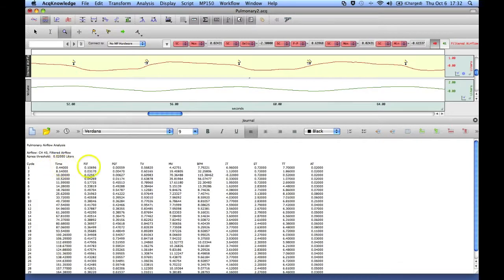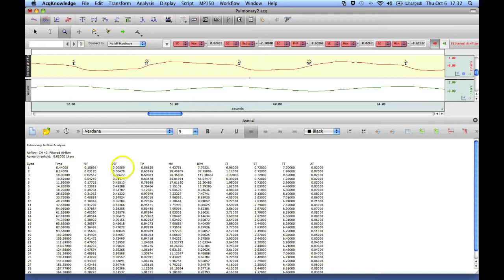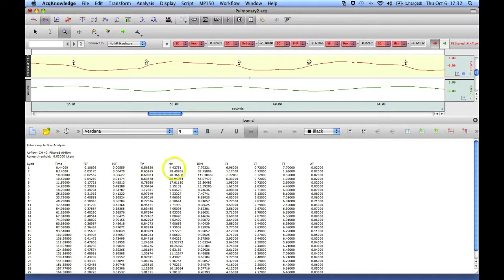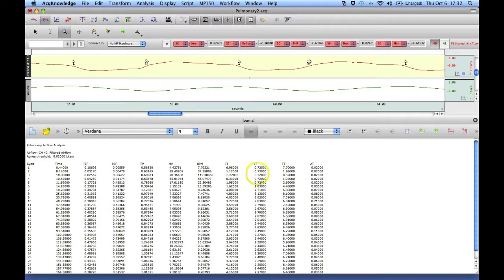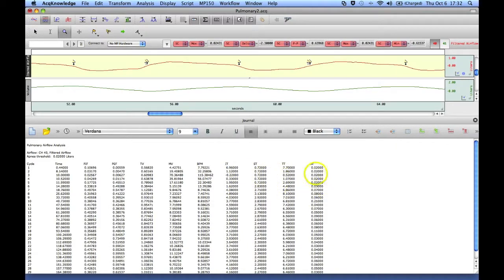the time, the peak inspiratory flow, the peak expiratory flow, tidal volume, minute volume, breaths per minute, inspiration time, expiration time, total time, and apnea time.